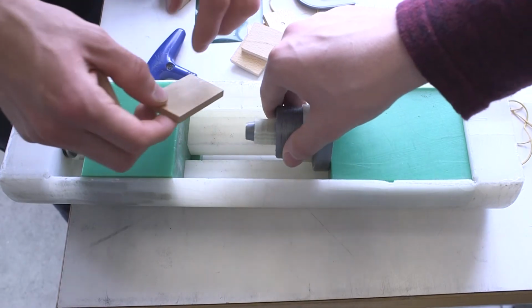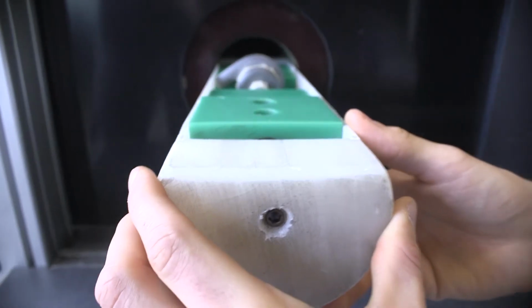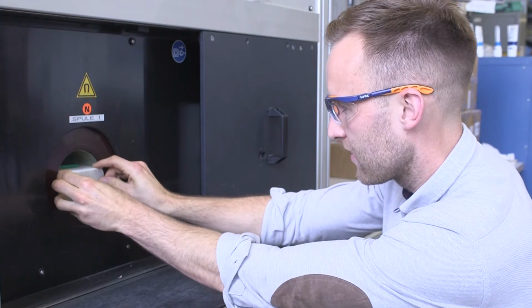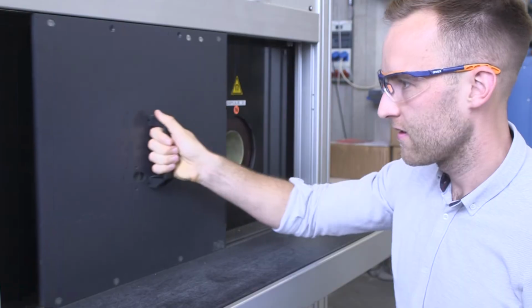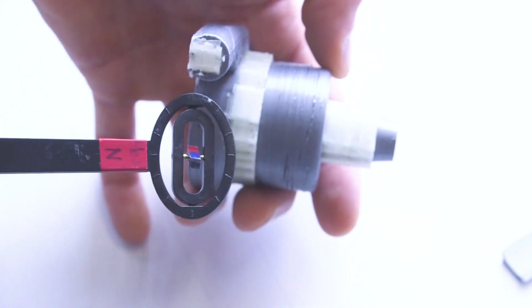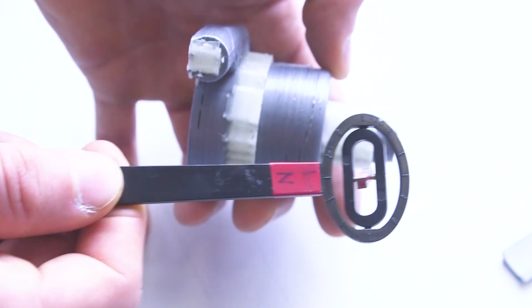The final step is to magnetize the part in a strong magnetic field. This is necessary because the powder that we use is isotropic, meaning that there is no overall magnetic polarization to it. Currently, we can only have one polarization direction for all magnetic regions in the part.